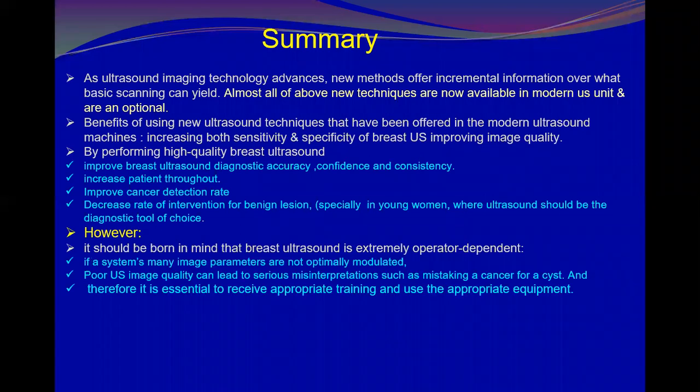However, it should be borne in mind that breast ultrasound is extremely operator dependent. If a system's many image parameters are not optimally modulated, poor image quality can lead to serious misinterpretations, such as mistaking a cancer for a cyst. And therefore, it is essential to receive appropriate training and use the appropriate equipment.